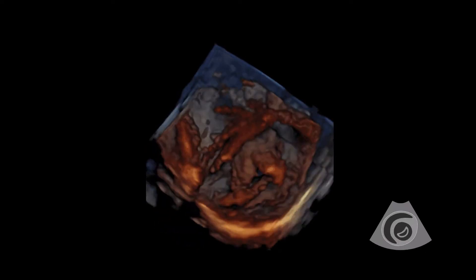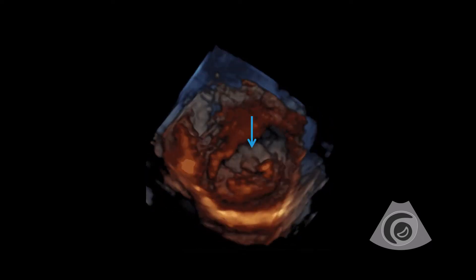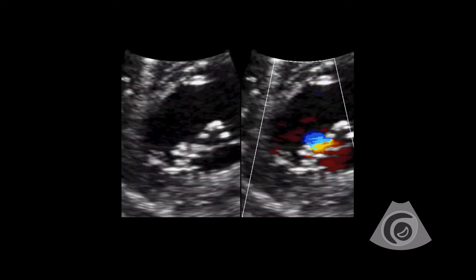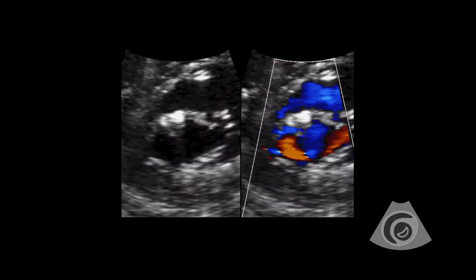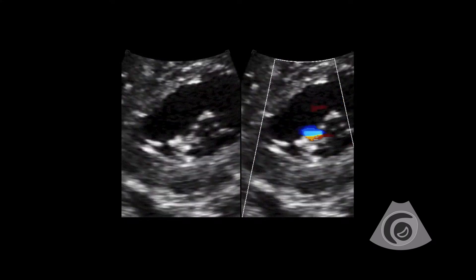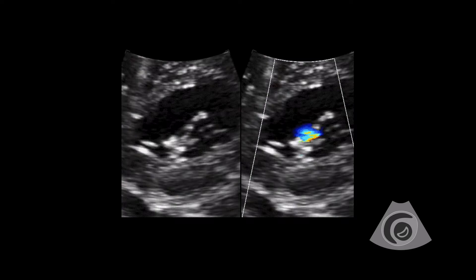Repair of the left AV valve is also undertaken, usually by stitching together the two most anterior leaflets to bicuspidize the left AV valve. In the image on the left, the echo bright area on the valve is a suture. This valve has already been repaired. The image on the right shows that the regurgitation remains in the same location as the repair.